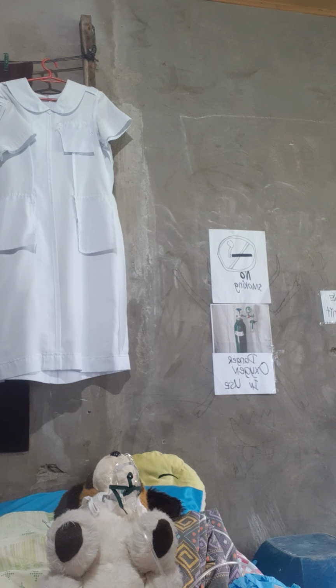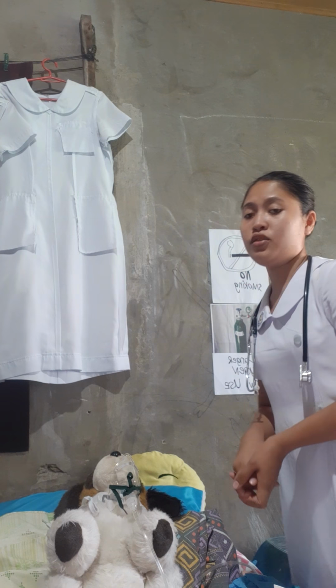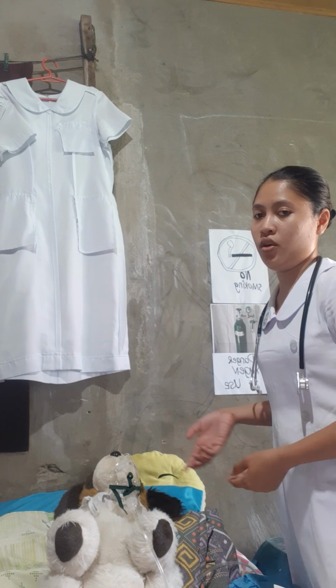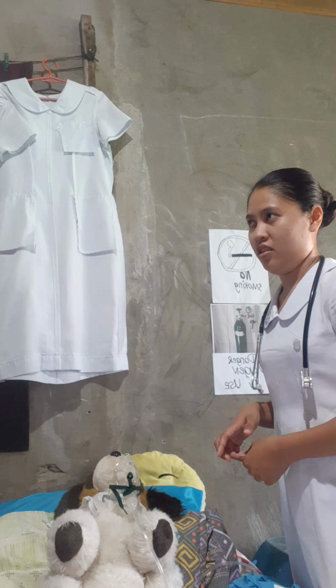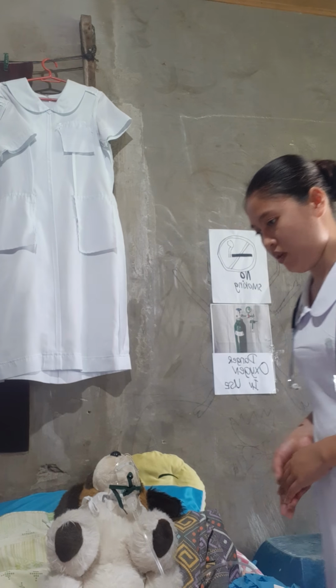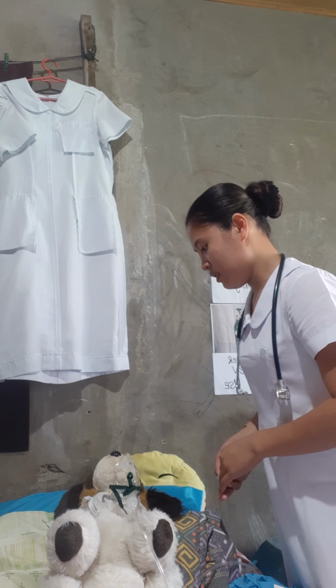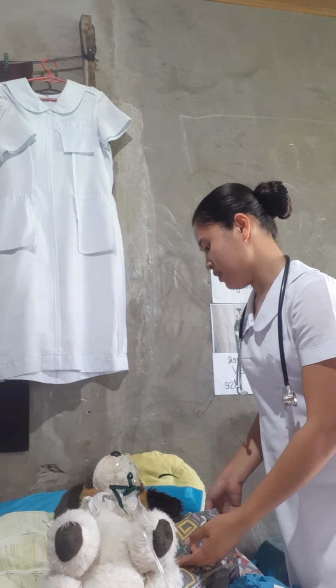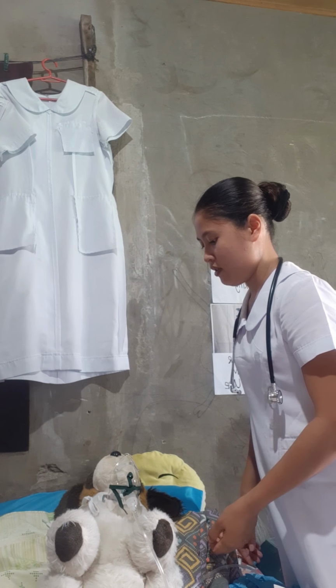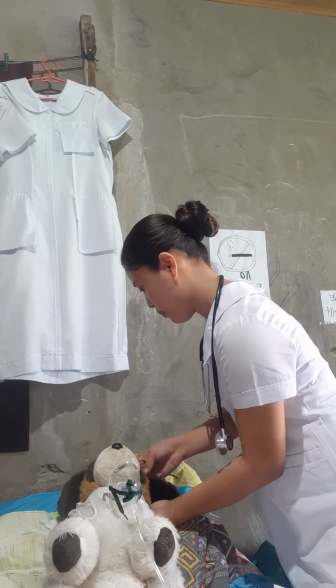Then afterwards, if the patient is conscious, we are going to assist the client into semi-Fowler's position, and if the client is unconscious, keep him in a lateral position. So, excuse me, sir, I will just assist you into this semi-Fowler's position. I hope you can cooperate. Okay, thank you.